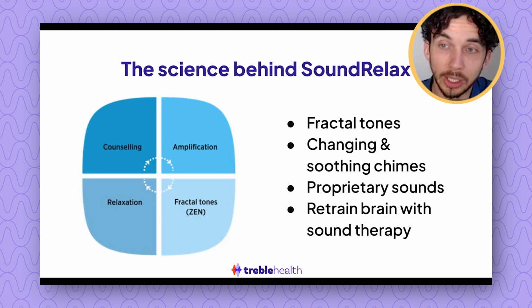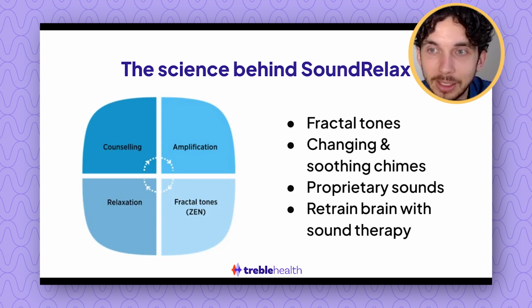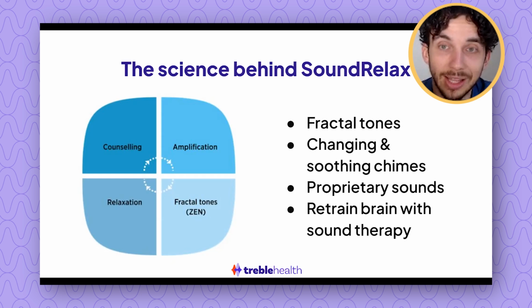The goal here is to retrain the brain where the tinnitus is coming from, where we find the tinnitus. It's in the auditory brain. The goal here is to reduce that over time by using this sound therapy during most waking hours. And let me stress that this does work. There is absolutely hope for you if you're looking for sound therapy to be a treatment for tinnitus. This, in my opinion, is something that most people get wrong, but those who get it right and have the right program in place have consistently shown their ability to reduce the perception, the awareness, and very often the volume or the loudness of tinnitus.